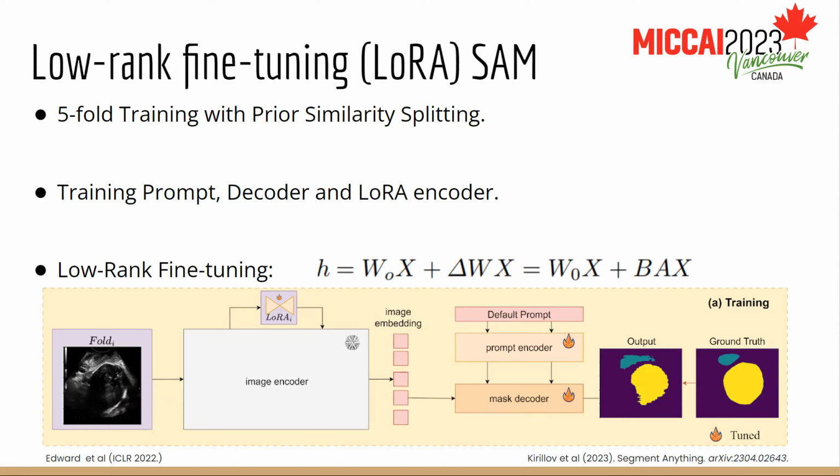But if you focus on the ultrasound imaging over the high frequencies, you will actually not be converging to your task, given that ultrasound imaging suffers from this high frequency speckle noise.